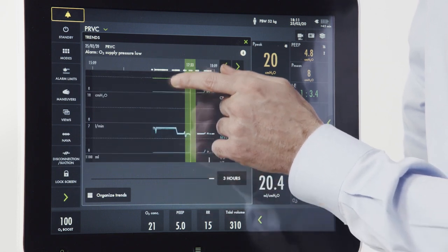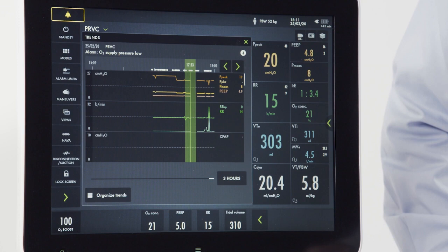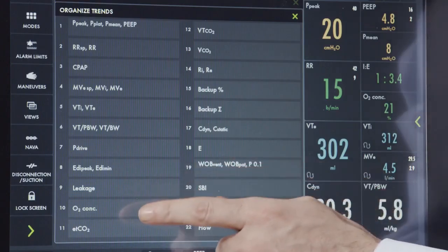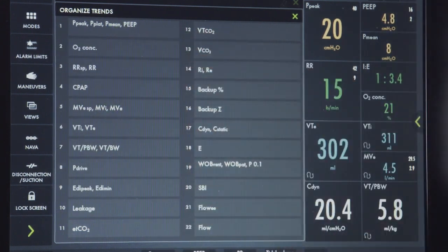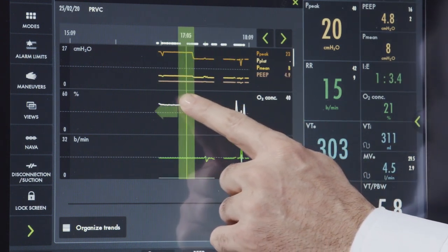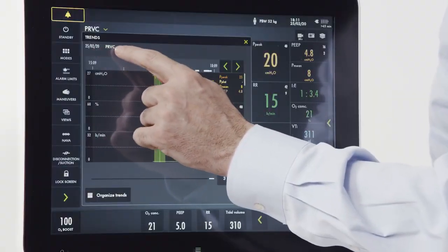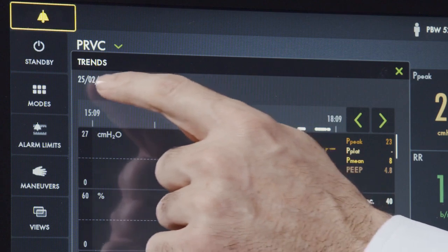By taking my finger and scrolling up or down, I can view the displayed parameters. I also have the ability to organize them by dropping and dragging the parameters into any order desired. Once set, I can take my finger and scroll left and right to see parameter information at different times. In the corner, I can see my mode and any events that have also taken place at that moment in time.